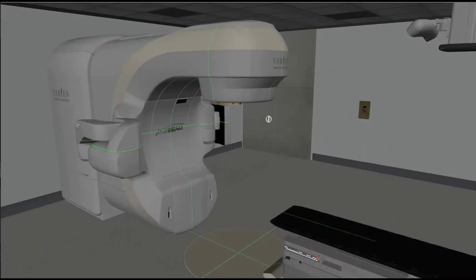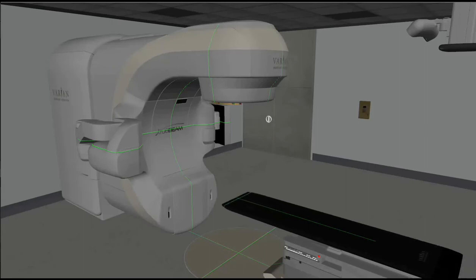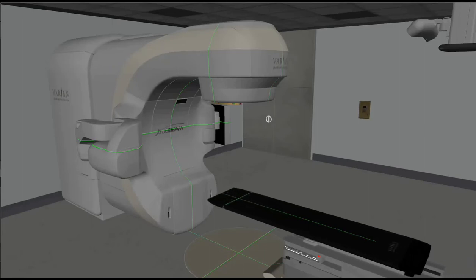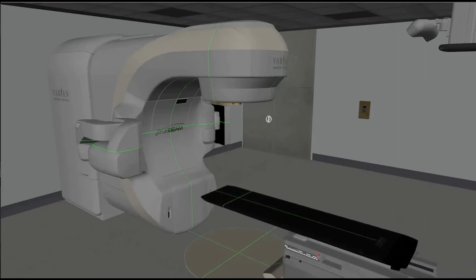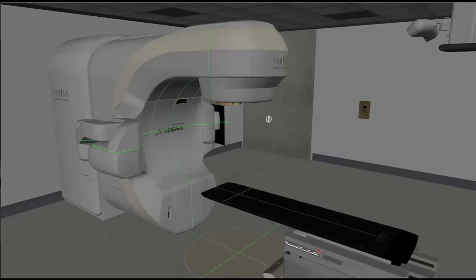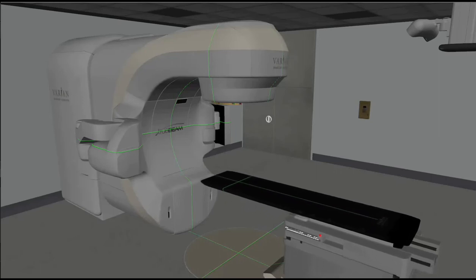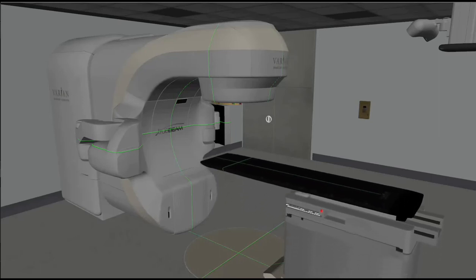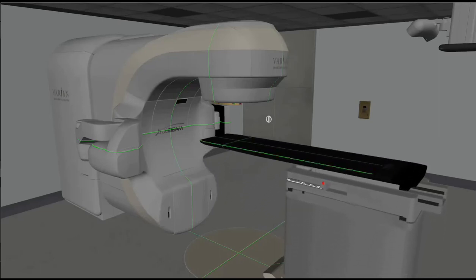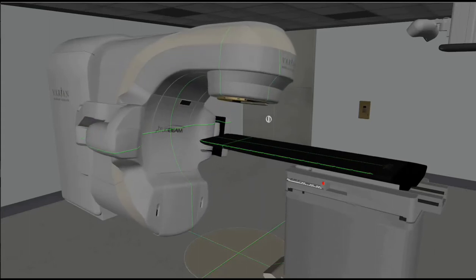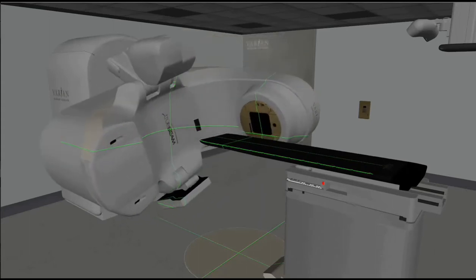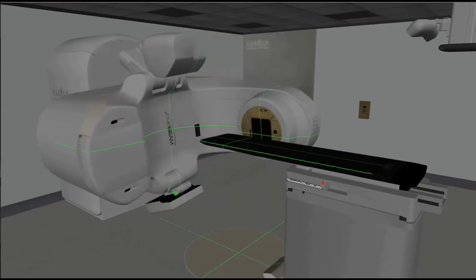The system comes with the manufacturer pendant to control the LINAC. You can see the bed movements, gantry and couch-mounted movements, which are a simulation of the real-life machine. The only difference is this training solution does not deliver ionising radiation — it is the flight simulator of the linear accelerator.